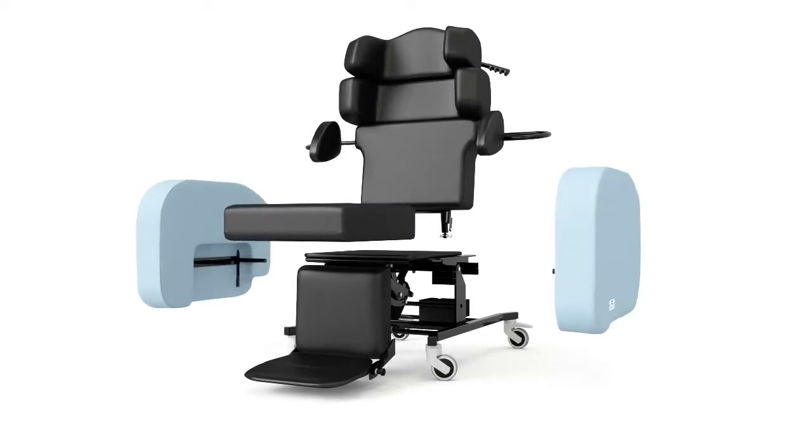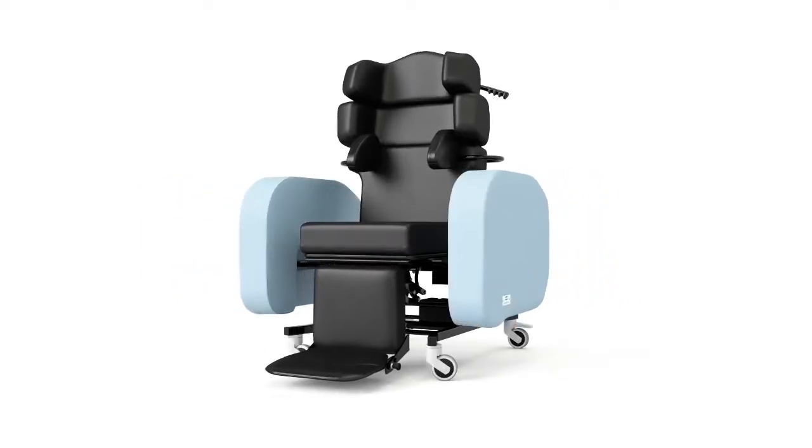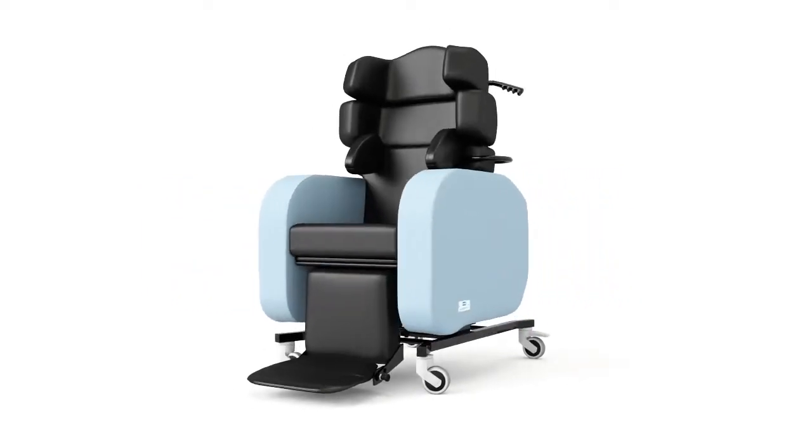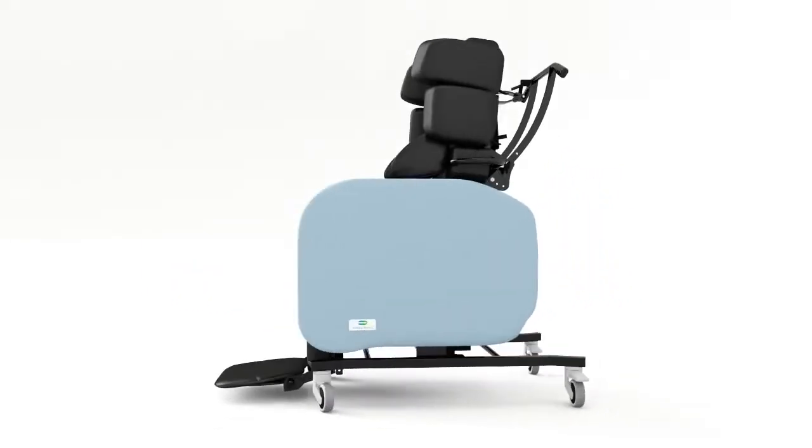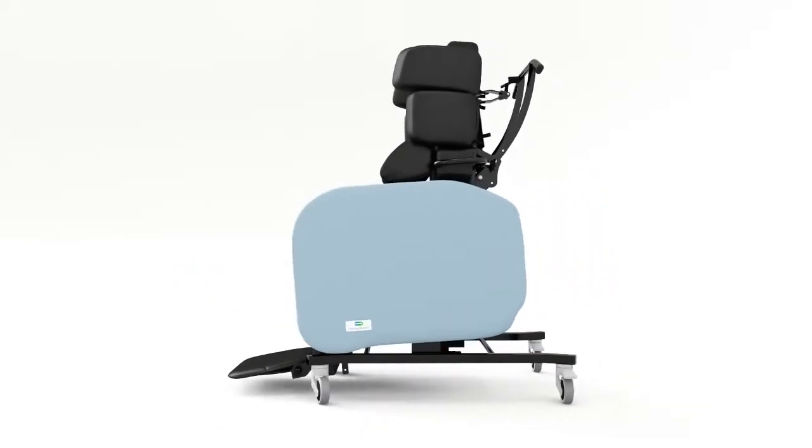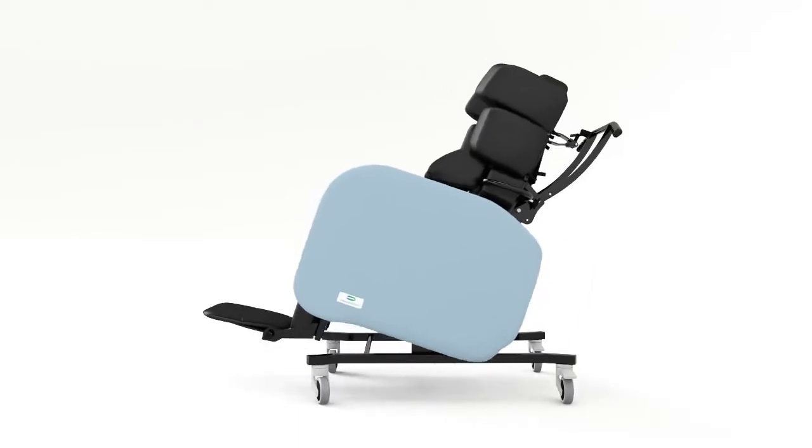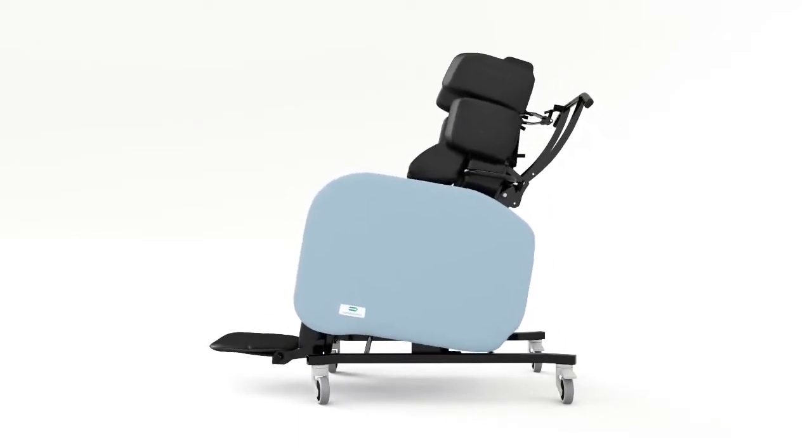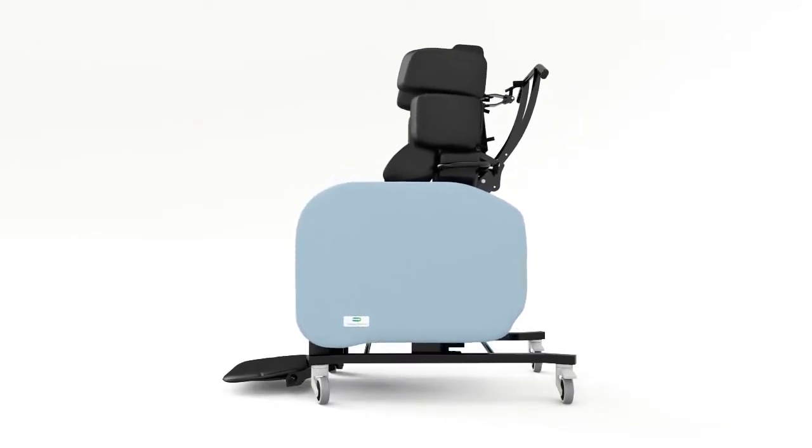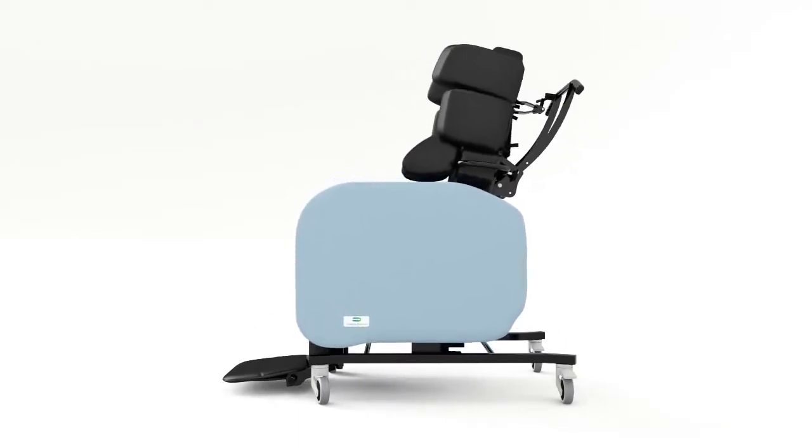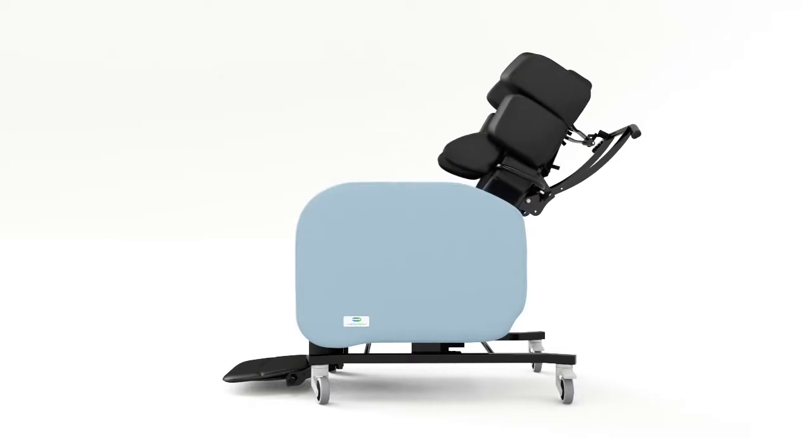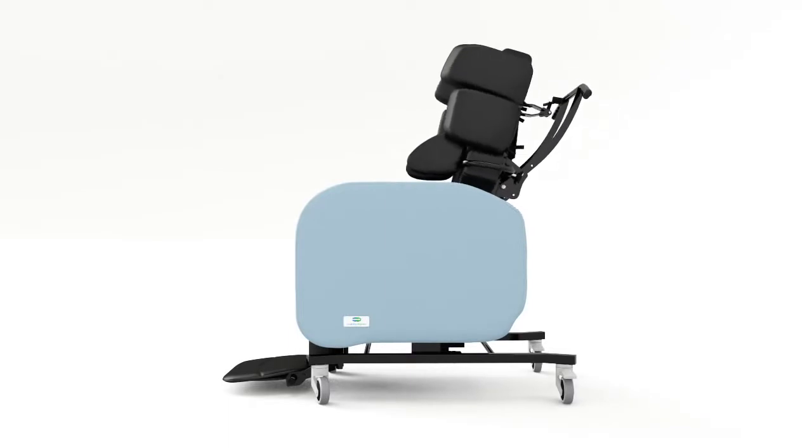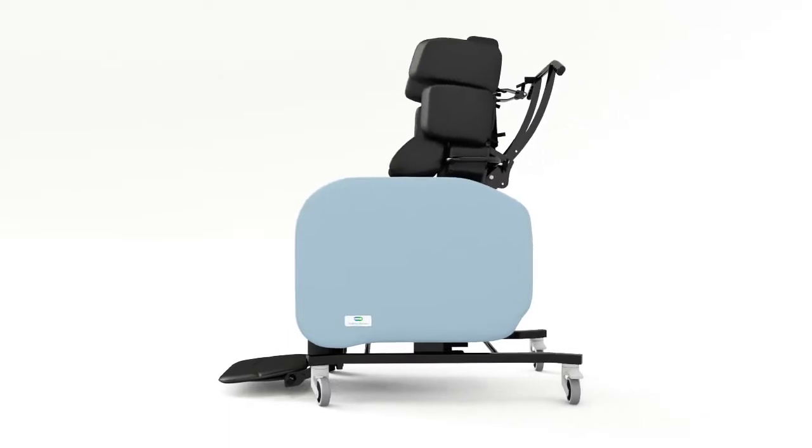The Seating Matters Phoenix is a multi-adjustable tilt-in-space chair. It has powered and manual forward tilt and backward tilt options to a maximum of either 30 or 45 degrees, together with an optional back angle recline.